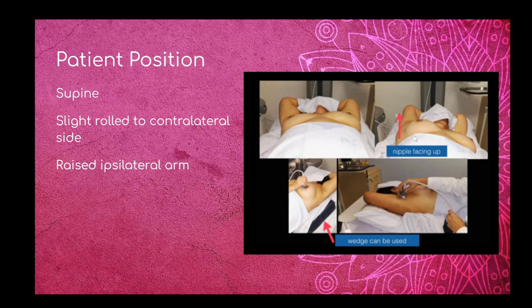It's going to make the lateral portion of the breast much easier to access as well. And then we know if everybody kind of rolls their patients into this flattened position, that we can easily find lesions that we might come across. We can find them again next time the patient comes in for maybe their biopsy or their wire loc.